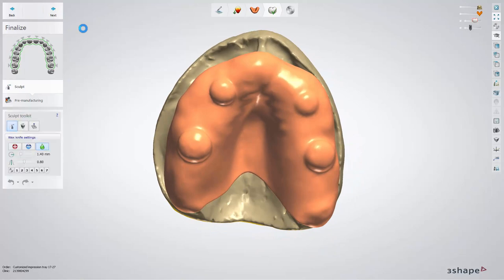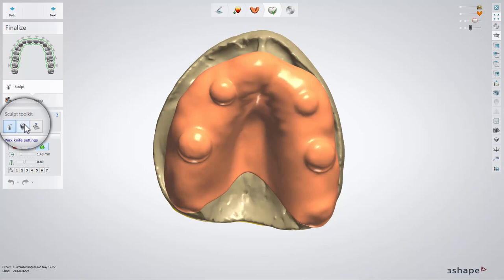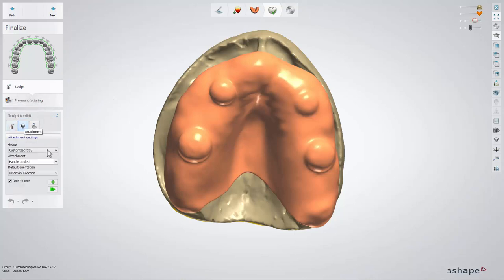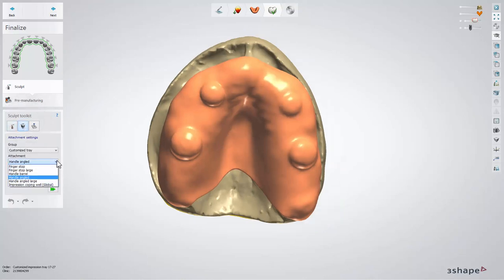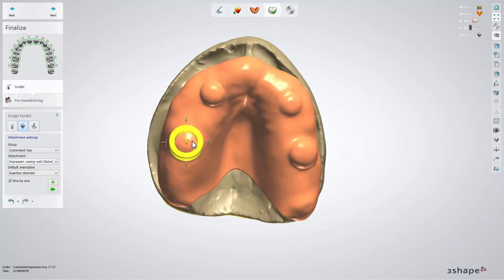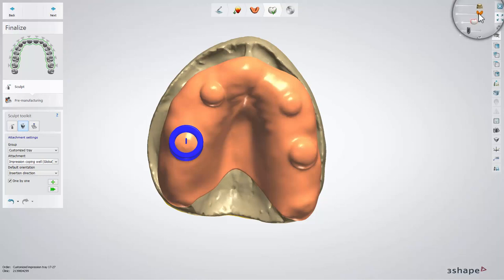Our example includes a plaster model with healing abutments. This is why we need to make the openings for impression transfers. To do that, from the attachments menu we will choose Impression Coping Well Global. Place it where the healing caps are. Make sure that the axis of the impression coping well is parallel to the insertion direction of an implant. Make the 3D bite plate less visible and use the control points to position it correctly.